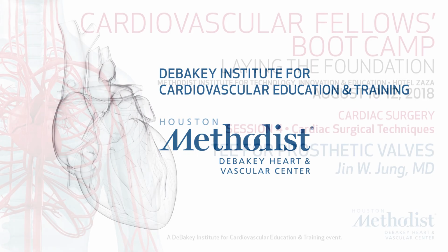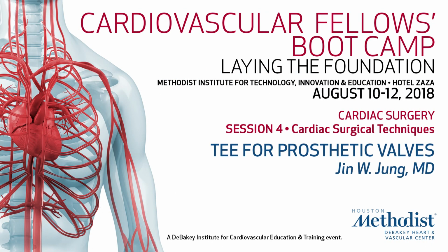Everybody, I'm Jin. I was one of the fellows, and I was like you guys last year in our first boot camp that included anesthesia fellows. So, TEE for prosthetic valves.